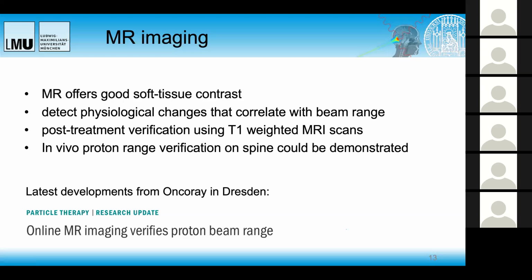And I would like to close my talk with one outline, or one very preliminary study, but there are also colleagues in Dresden who are now also working on online MR imaging to verify the proton range.